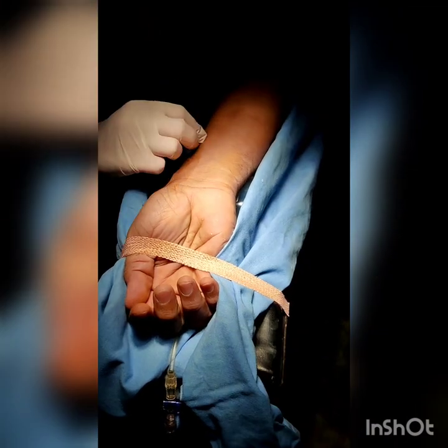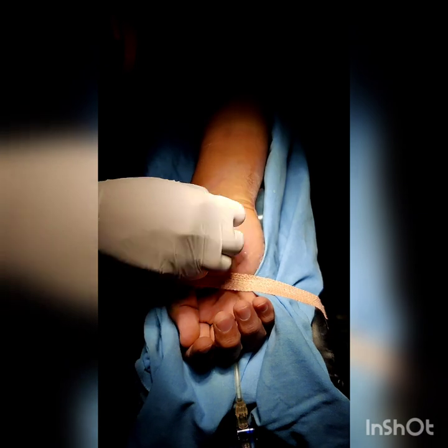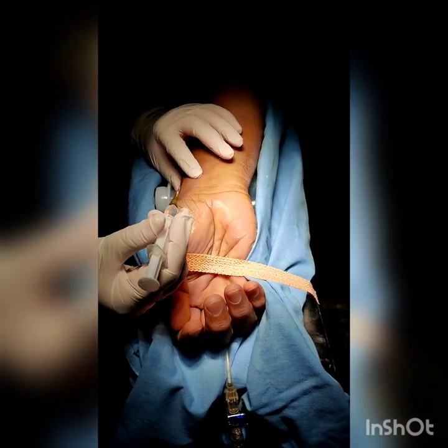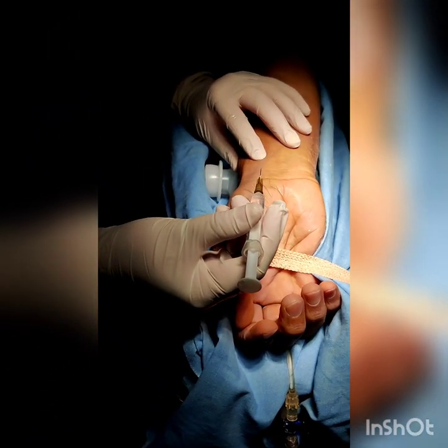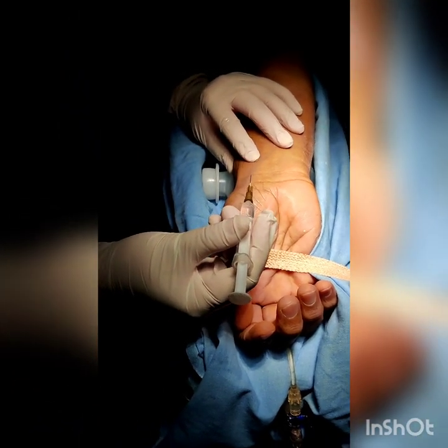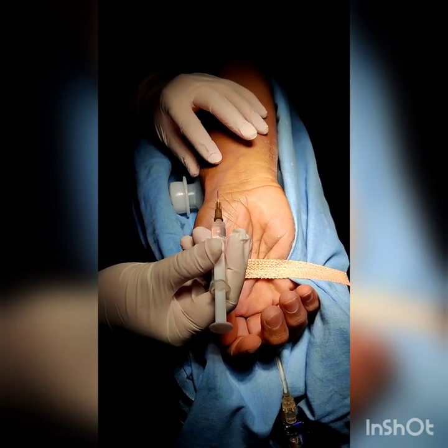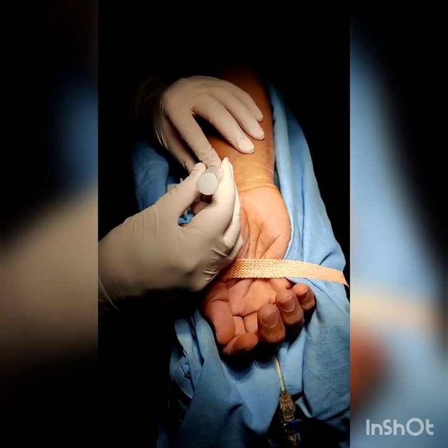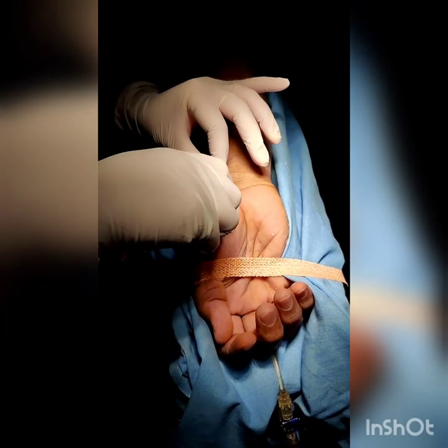Clean the area with spirit or 2% chlorhexidine. Using surface landmarks, palpate the radial artery around 2cm proximal to the wrist crease. Give local anesthesia if the patient is awake, using a short 26-gauge needle by injecting not more than 0.3 to 0.5ml of 2% lignocaine. Keep the injection superficial.